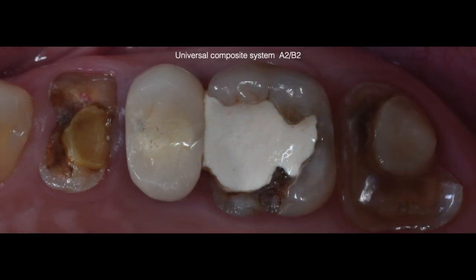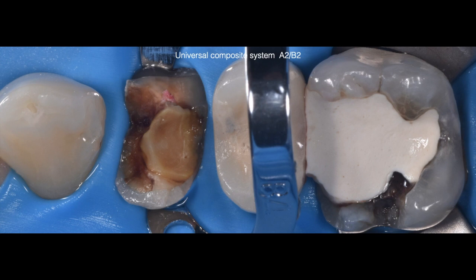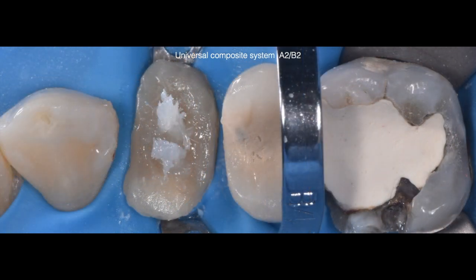As you can see, tooth number 12 has fractured off to the gum line, and there is a large temporary restoration on tooth number 14 that we are going to restore using Brilliant Everglow A2B2. Ideal rubber dam isolation was achieved. After caries removal and cleaning of the substrate, a total etch technique was used in combination with One Coat 7 Universal. Deep margin elevation was completed and two braided fibers were packed into the canal orifices.